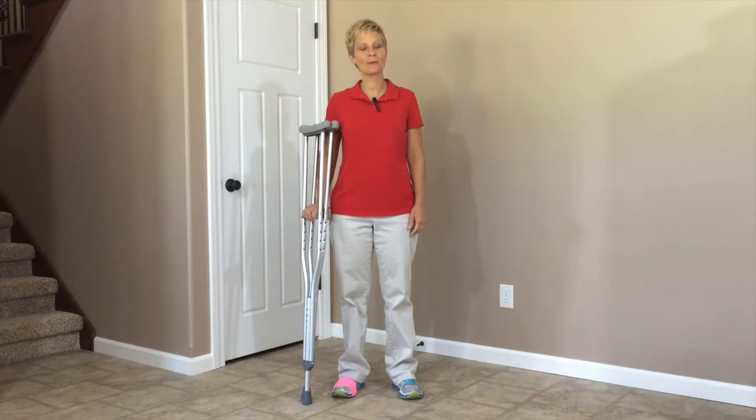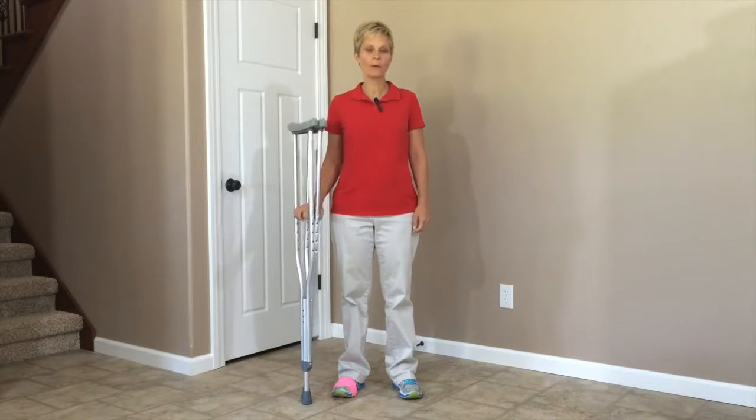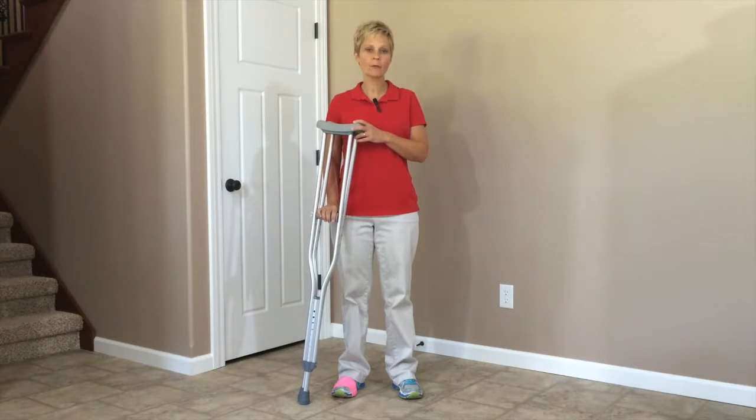Hi, Cindy here, physical therapist with Adaptive Equipment Corner. Today we are talking about crutches. We are going to talk about how to adjust crutches. In the following two videos we will show you how to use them and how to use them on stairs.